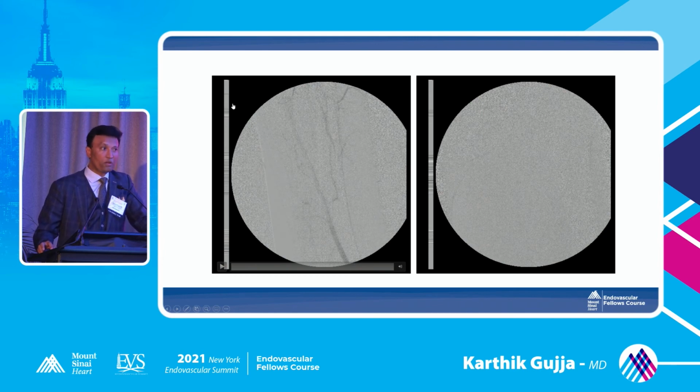If you think that your wire moves a lot when you're getting in and out of the devices, then Spider is not your filter, because it's going to move, because the filter is dependent on the wire. If you think your wire moves a lot, but you don't want a large device in the popliteal, and you want just minimal protection, or you're not atherectomizing a lot, then EmboShield is a great device, because the filter wire is completely independent of the filter itself. So no matter how much your wire moves, your filter is not going to move from the position. Right. So that's the goal.